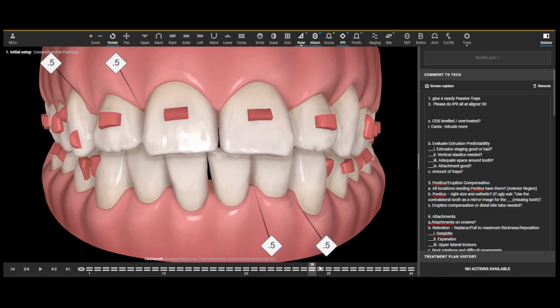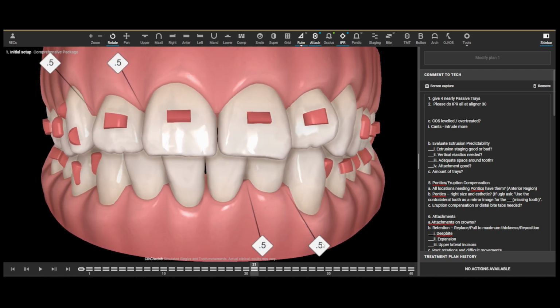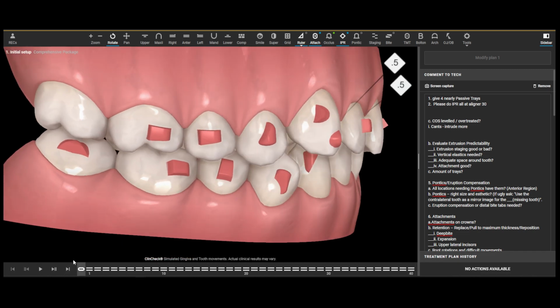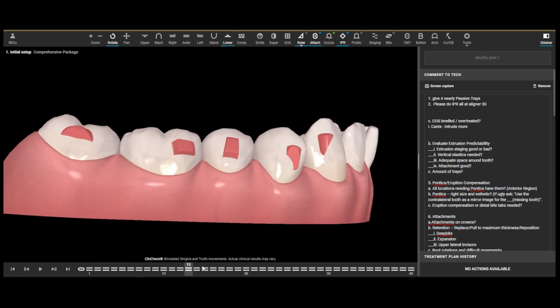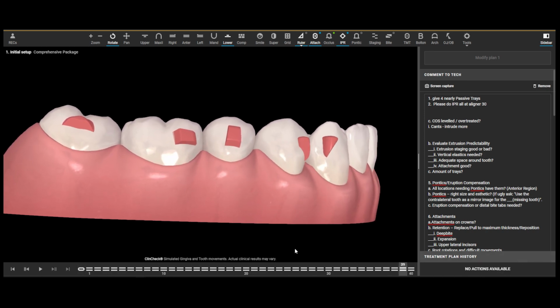Next one, extrusion predictability. Is anything extruding here that requires an elastic to help pull it down or anything like that? Well, no, not on our anteriors, but what about these guys? We're talking about how we're going to intrude all these upper teeth in quad 1. Well, all the lowers are all extruding. Every single one of them is extruding.